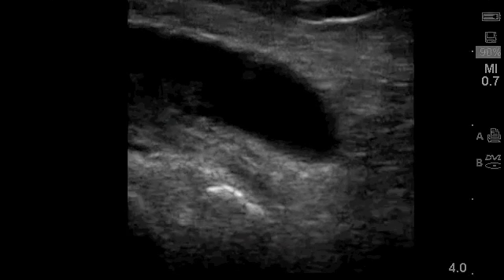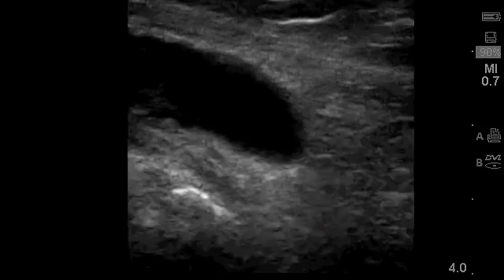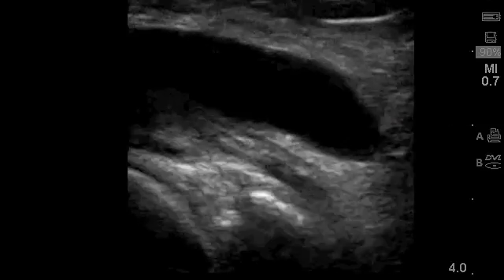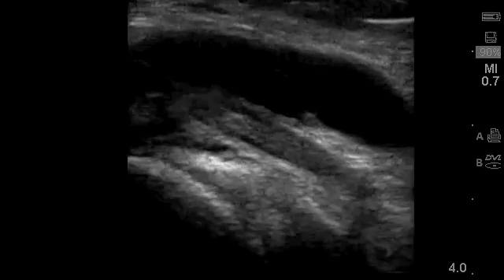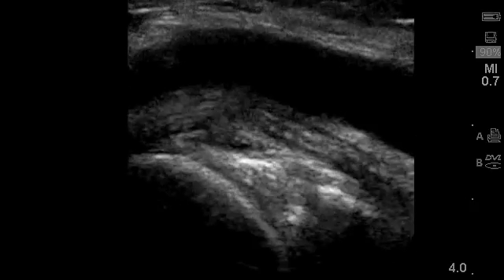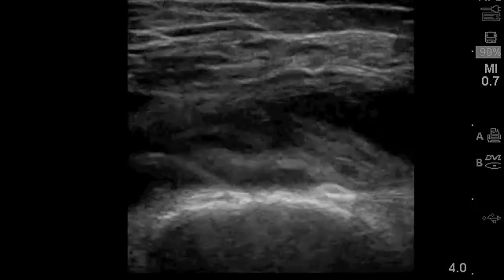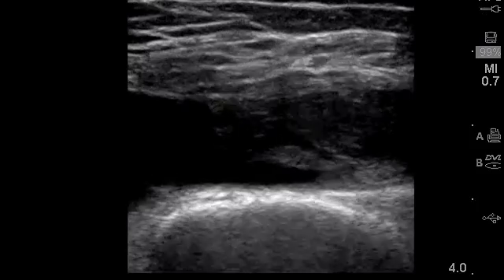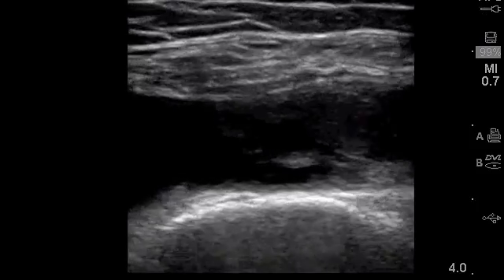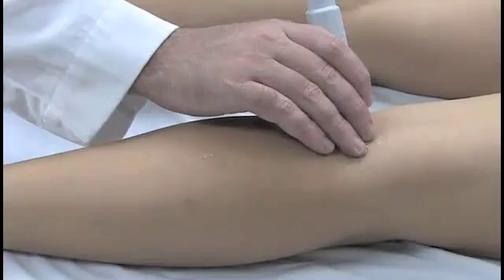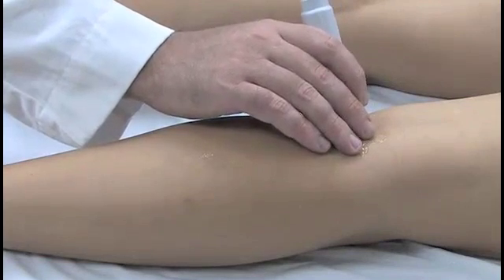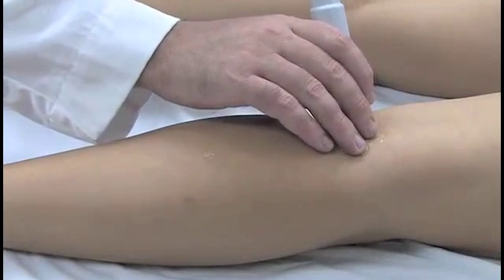Baker's cysts develop as a result of a communication between the knee joint space and the semimembranosis medial gastrocnemius bursa. A knee joint effusion can distend a Baker's cyst via this communication. Ultrasound is an easy and effective method of diagnosing a Baker's cyst.